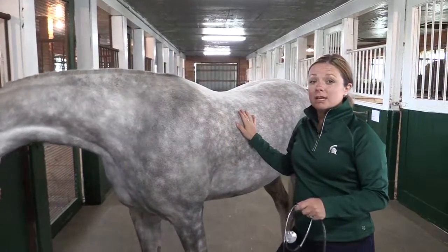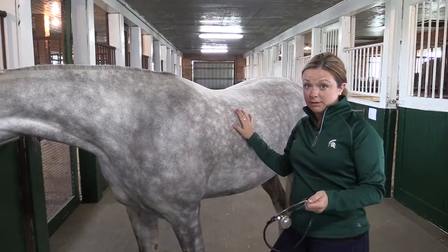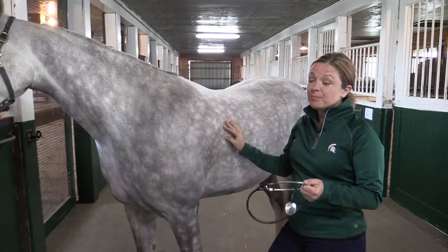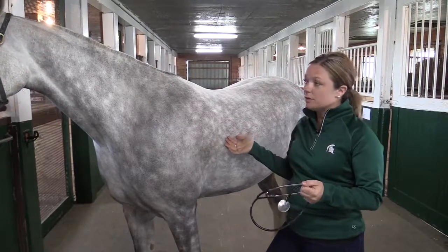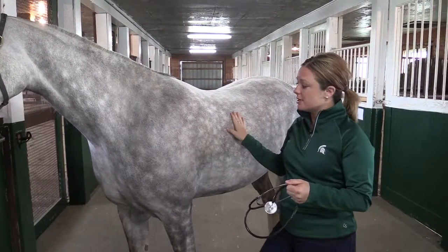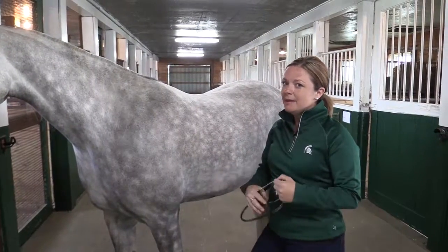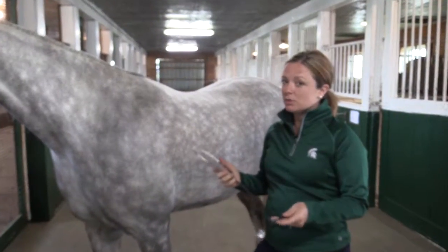Now let's talk about taking the horse's heart rate or their pulse. My favorite way to do it is using a stethoscope. You can try to palpate and feel the horse's pulse with a couple of different arteries, but I'll be honest I haven't had much success personally doing that, but I always have success using a good old stethoscope.